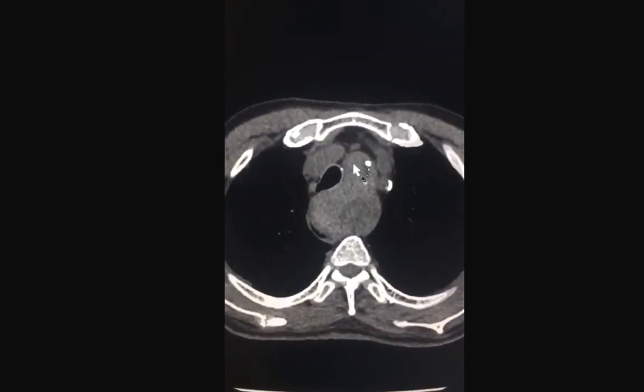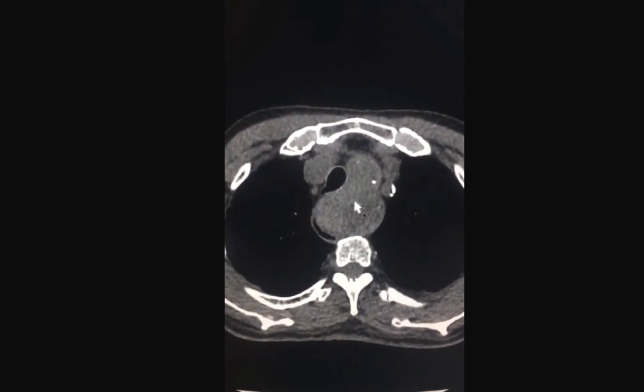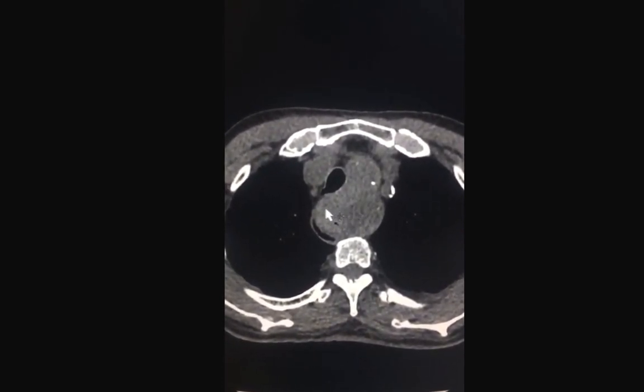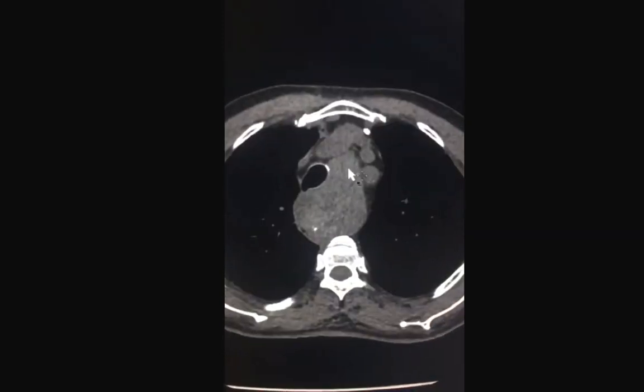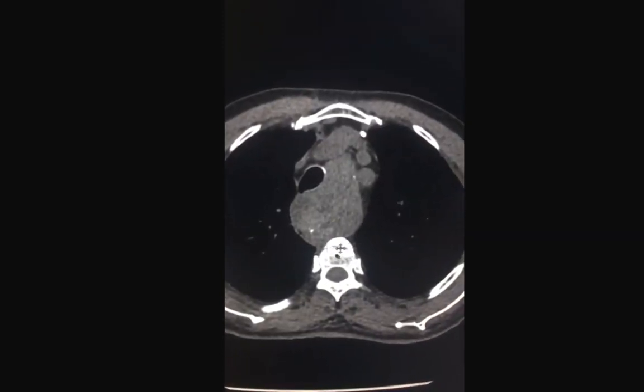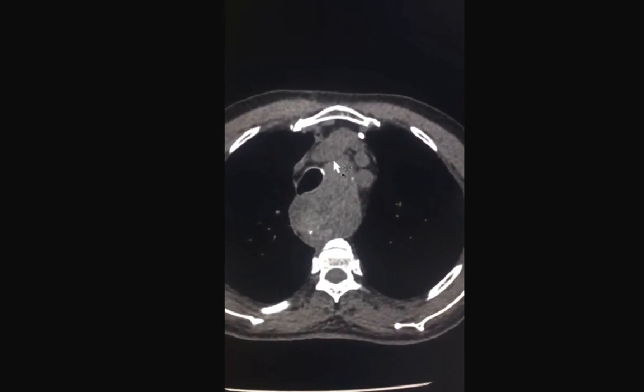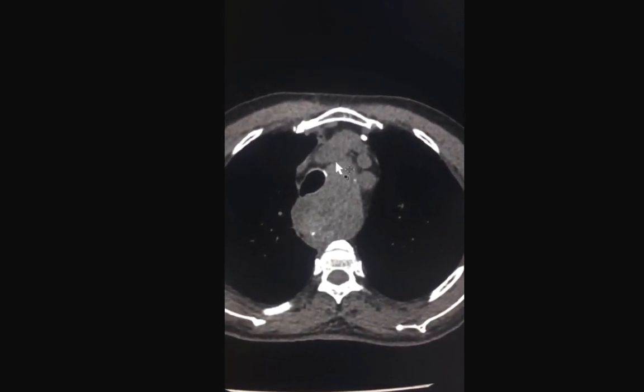And since thyroid abnormalities could extend anterior or posterior to the trachea, don't be surprised if you have what looks like a circumferential thyroid abnormality. Finally, we talked about important things to mention in the report. The effect on the airway, esophagus, and vessels is important, lymphadenopathy, and invasion.